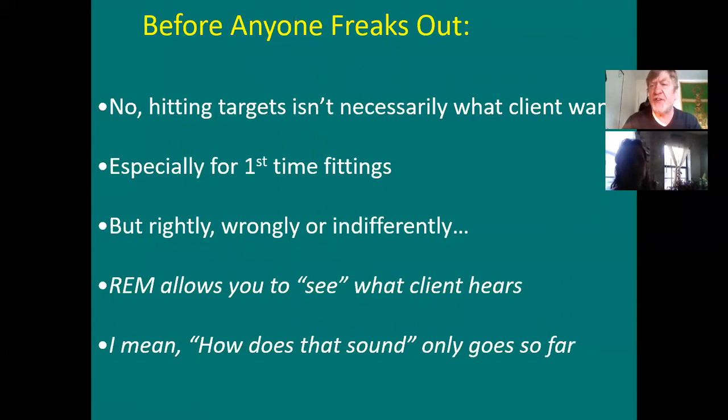Hitting the targets isn't necessarily what you always need to do, especially if a person's a new hearing aid wearer. You may want to actually underfit on purpose, and then later on boost things up when the person gets used to aided sound a little more. But here's what I say in the very middle sentence: right, wrong, or indifferent, Real Ear measurement allows you to see what the client is hearing. I mean, how does that sound? Goes only so far.